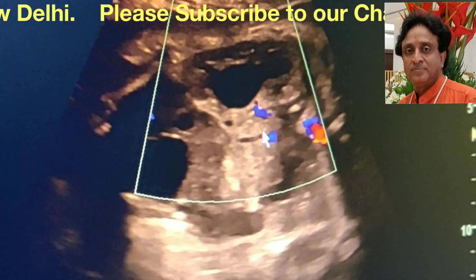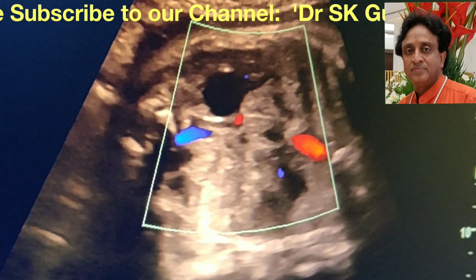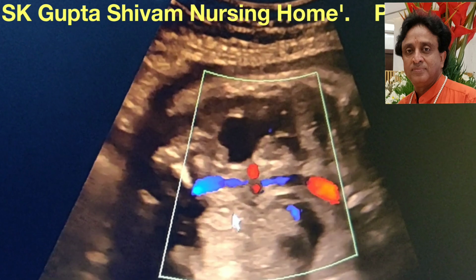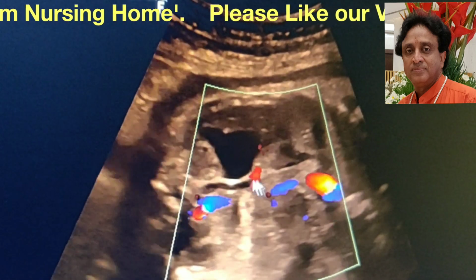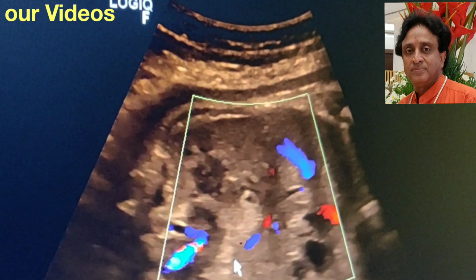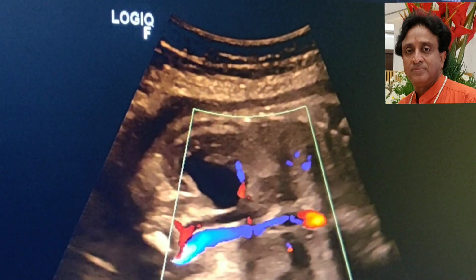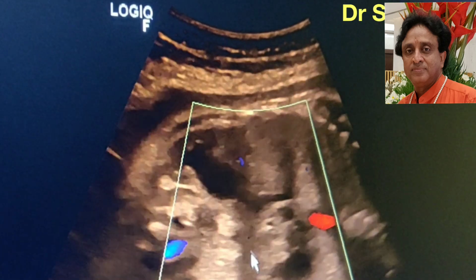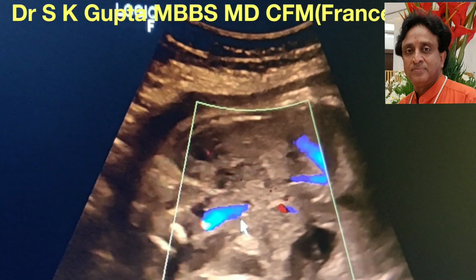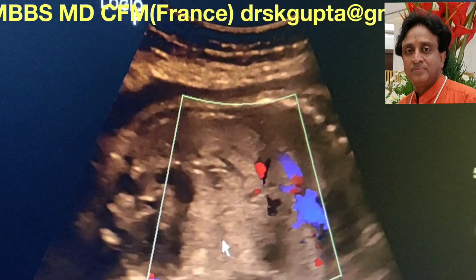I try to focus. This is the kidney now on the left side. This is the kidney slightly hyperechoic, and this is the kidney on the right hand side with dilated renal pelvis. And this is the renal vessel, and the renal vessel down below here is also seen occasionally. This is most probably the kidney. The baby has moved slightly.